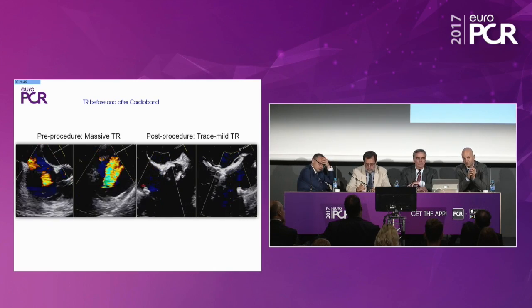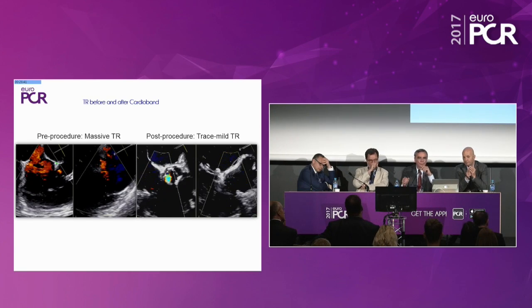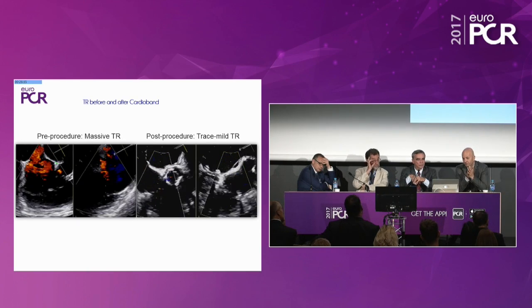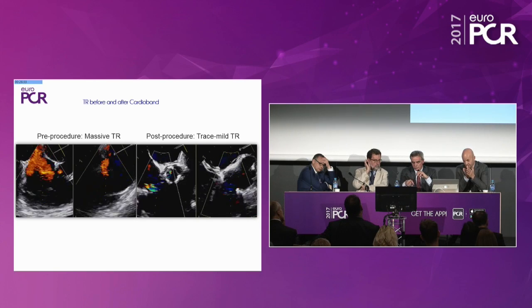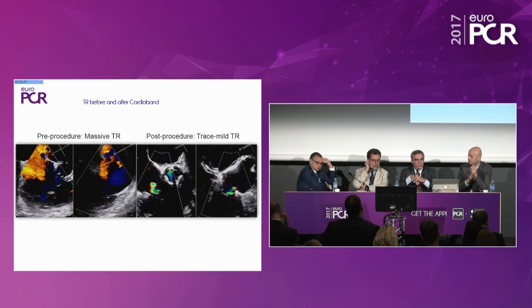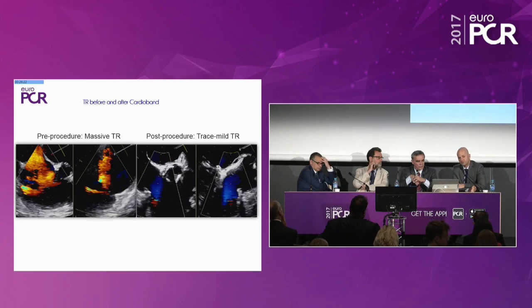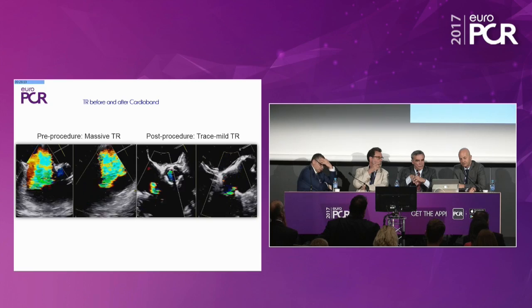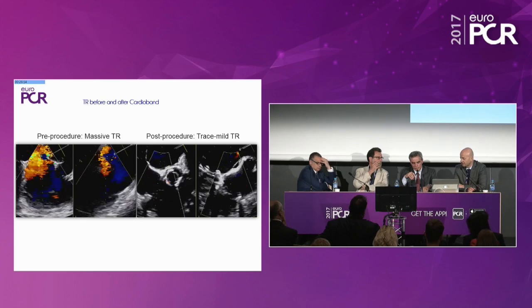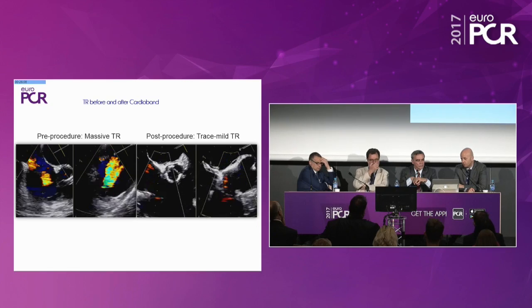And on the left side, you also have to cope with the circumflex artery, which can also be nearby. But you have echo and you have fluoro. You can go around the right coronary artery, and we even witnessed yesterday a case from Mainz, and we also have a case in Bonn in which we crossed the right coronary artery, and went up to the wall of the right atrium, if you will. And this is also doable. You can completely control it. You don't have to rush through the procedure. So I think it's safe, and the right coronary artery is an issue you can deal with.